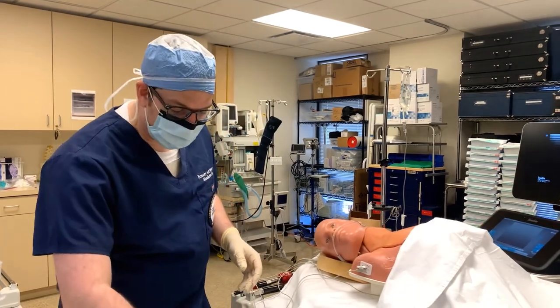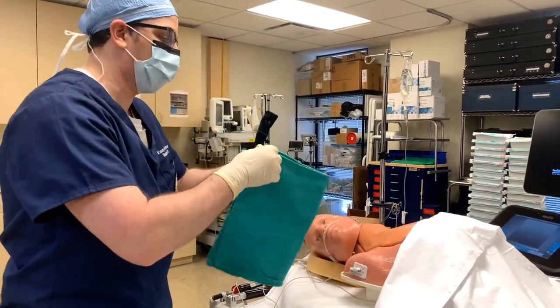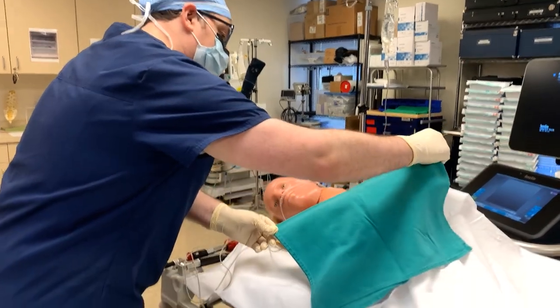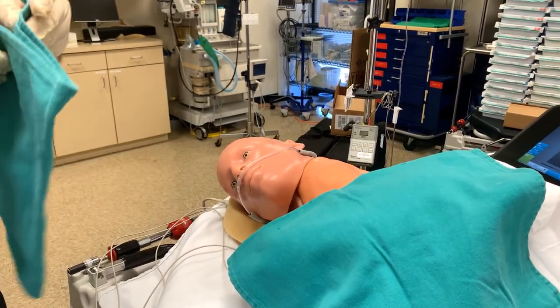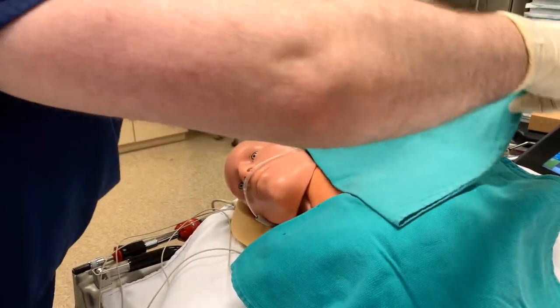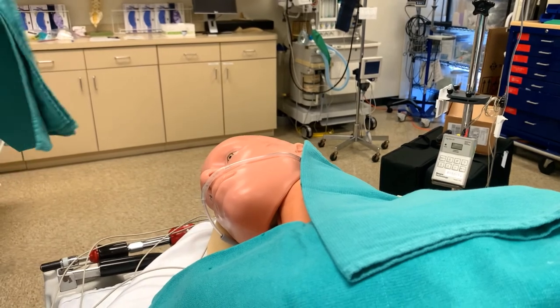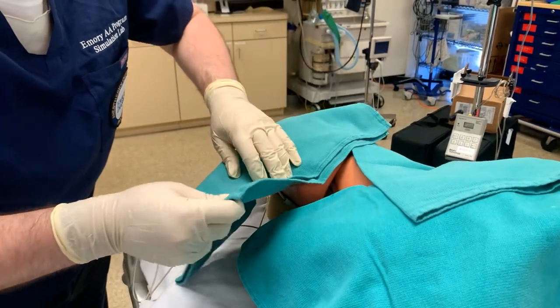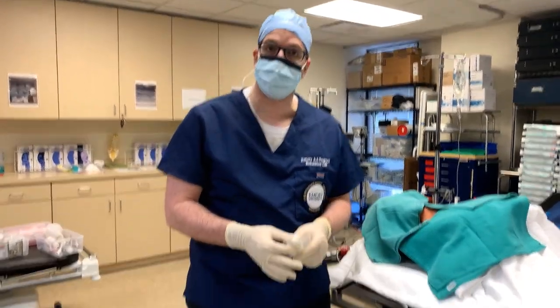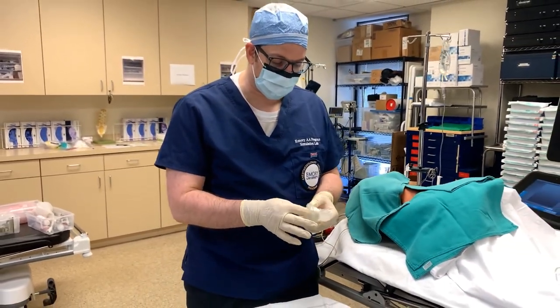At this point, we're ready to drape the patient. We're going to grab our sterile towels. Mr. Smith, I'm going to be putting some drapes on you here — I'm just going to ask you to hold real still. We're going to keep you nice and clean during this part of the procedure. We want a nice wide area. This last drape is going to go over your face a little bit — hopefully we won't be there for too long. The last step before we actually start the procedure is to place the sterile probe cover onto the ultrasound probe, and at this point I'm going to need some help from an assistant.